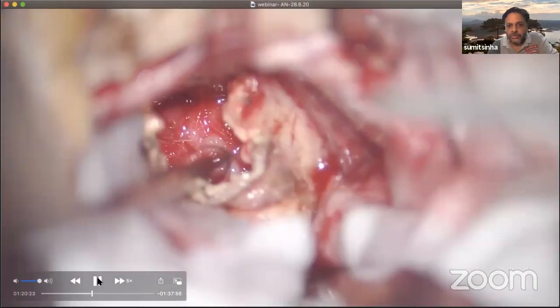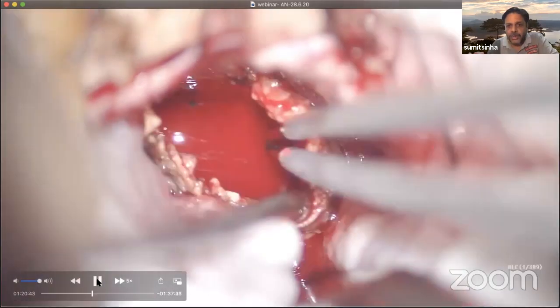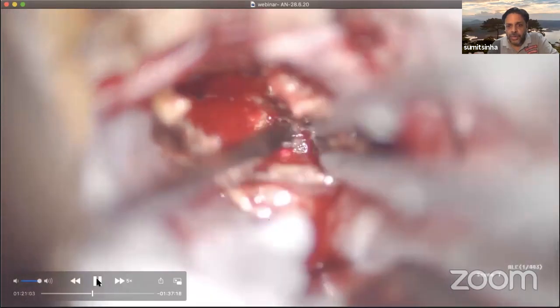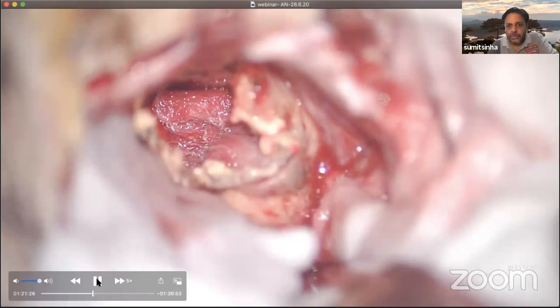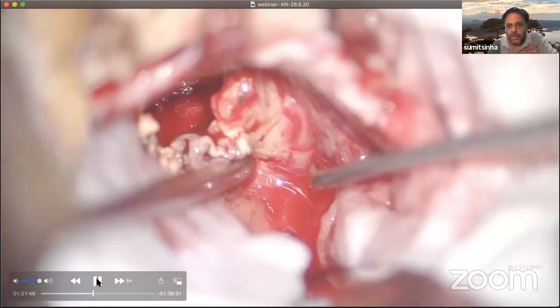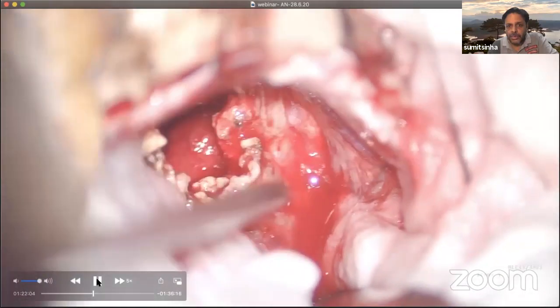It's been about the middle of the surgery, and it is imperative for me now to find the location of the seventh nerve. I have to find it now. This is high time during the surgical procedure. And soon you will be able to see that there is something of importance right now at this part of the surgery.